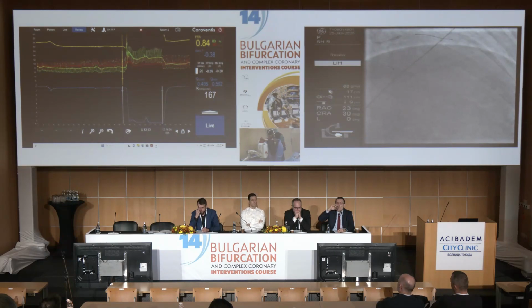So we have hyperemia, we just had rest, we can compare, and now we can, of course, calculate the coronary flow reserve. In absolute terms, we can calculate the microvascular resistance reserve in absolute terms. All these measurements, we will discuss that with the support of the slides. But I would say that's it. It's not more than that. Impressive. It's a very nice example.